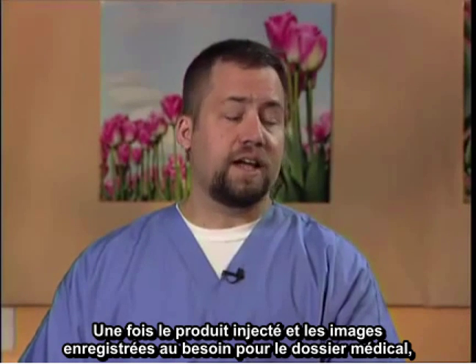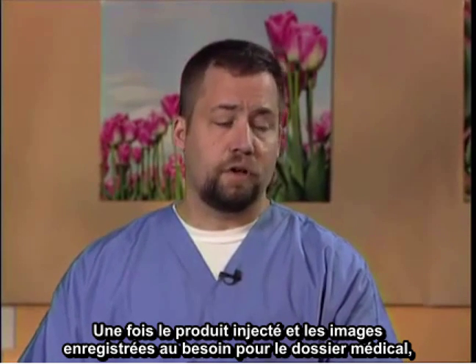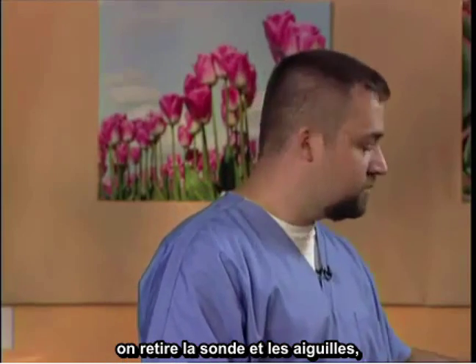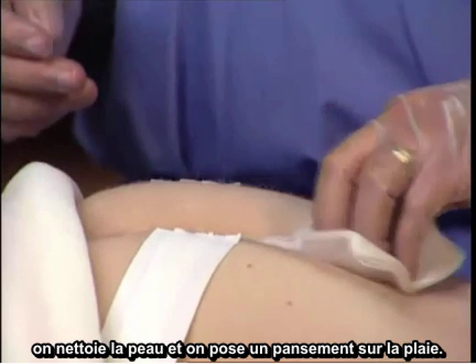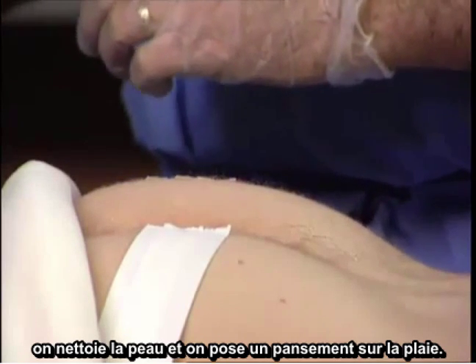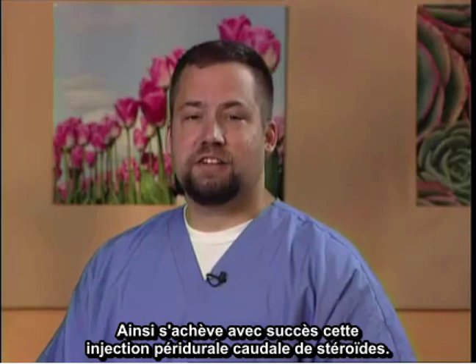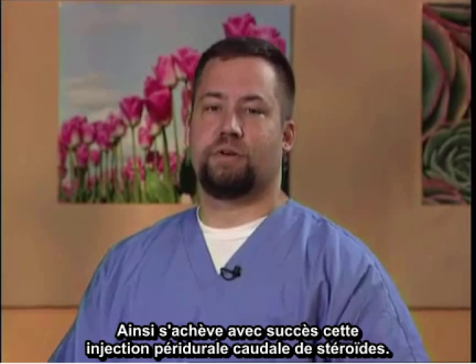Once the injectate is done and the image is recorded as necessary for the medical record, the probe is removed, the needles are removed, the area is cleaned, and then a band-aid is placed over the wound. And thus this concludes a successfully placed caudal epidural steroid injection.